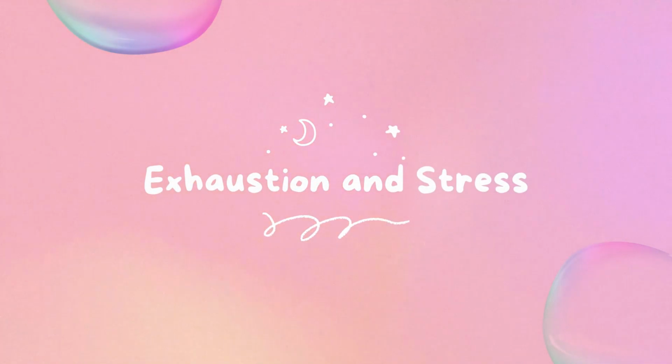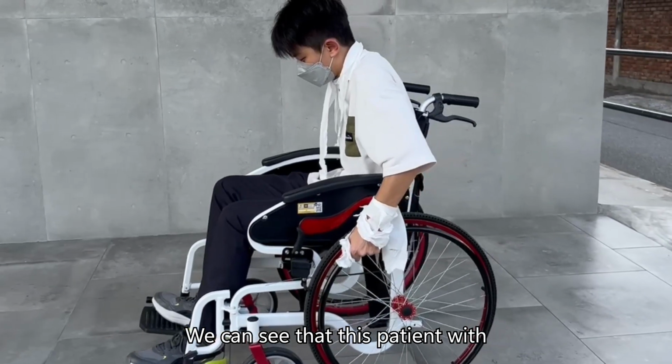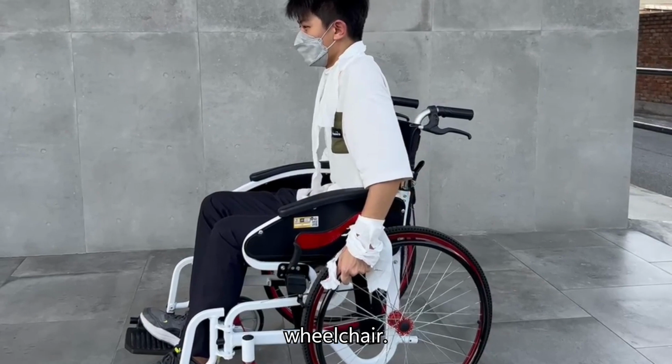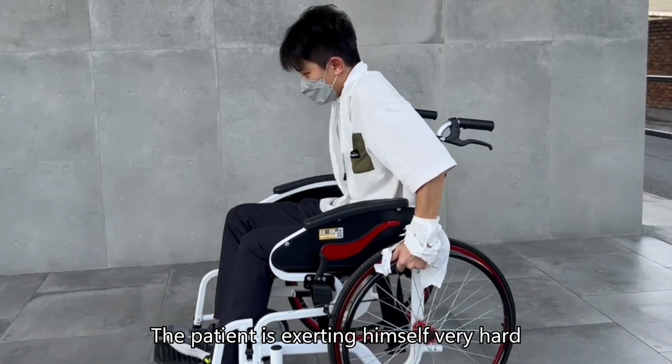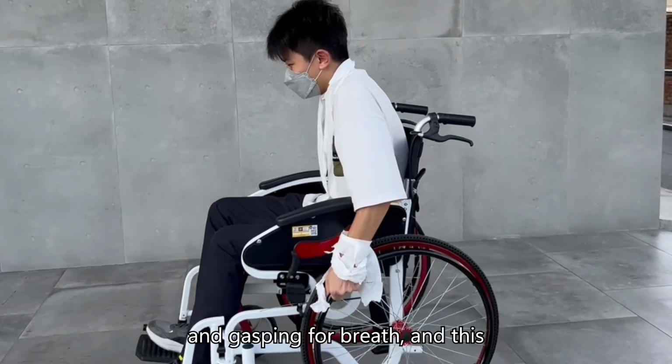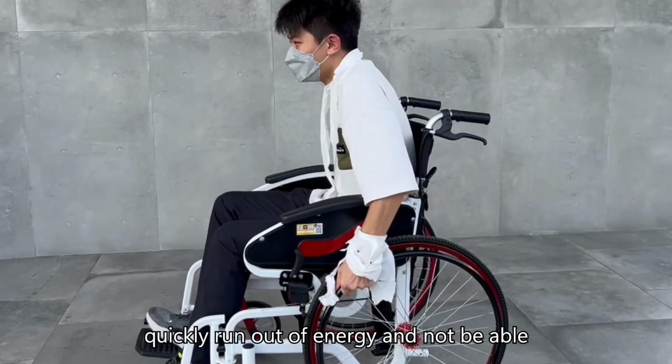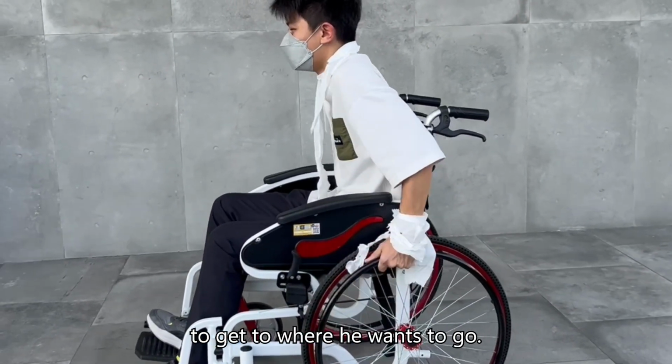Exhaustion and stress. We can see that this patient with fractures in both hands needs to use a great amount of force to push the wheelchair. The patient is exerting himself very hard and gasping for breath, and this wheelchair will cause the patient to quickly run out of energy and not be able to get to where he wants to go.